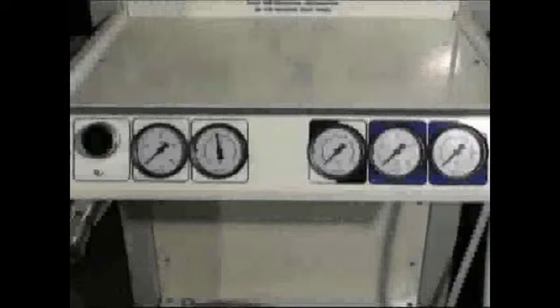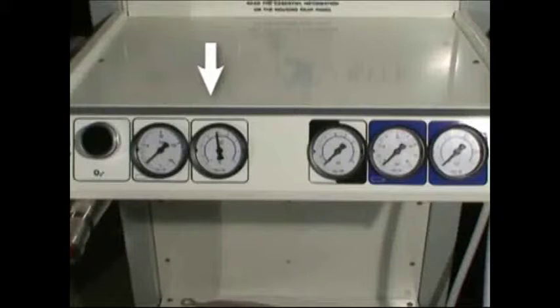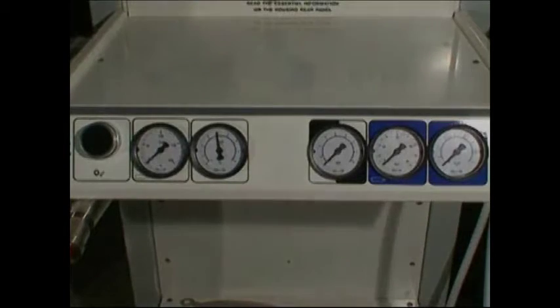The 5 manometers installed in this anesthesia machine are designed to monitor the existing pressure in the oxygen cylinder, the pressure coming from the hospital's central oxygen supply, compressed air, the existing pressure in the nitrous oxide cylinder, and the pressure coming from the hospital's central nitrous oxide supply. Depending on the configuration, some of the manometers may be optional.